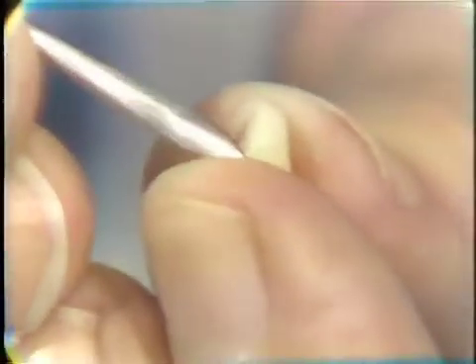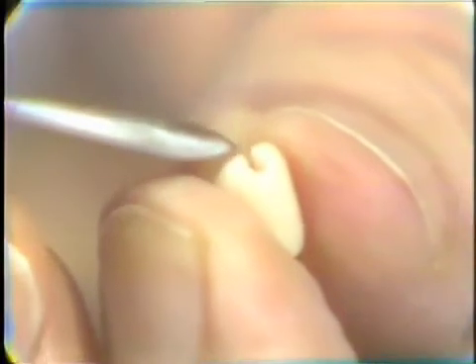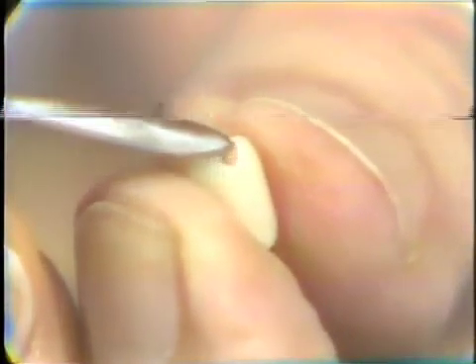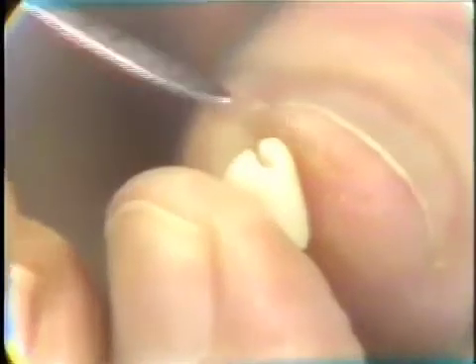So we're going to put a bevel just along here in the region of the contact on the distal and on the mesial, so that the gold occlusal will extend down a little further in the interproximal areas and give a better relationship for contact. There's one other thing that can be done too. You remember how a Steele's flatback is finished at the cervical end to cover over the key. Well, a similar thing can be done here.